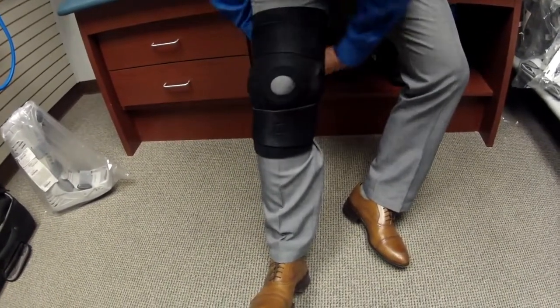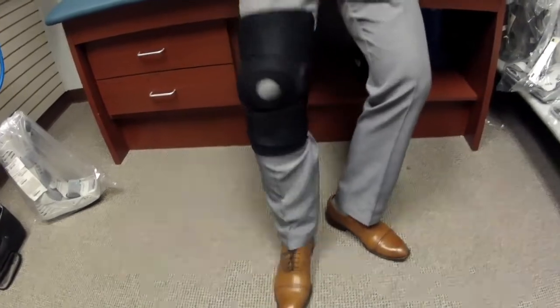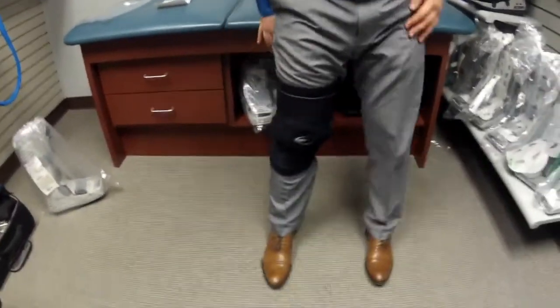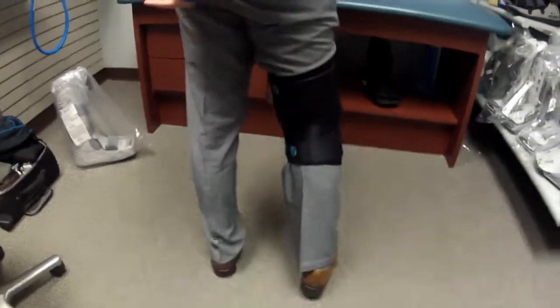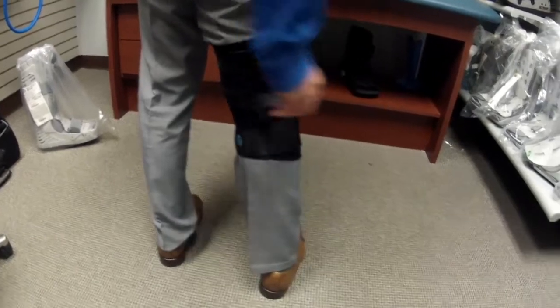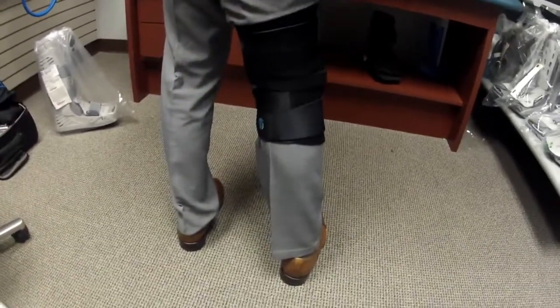Once all your straps are securely fastened, recheck the alignment on the patella and the position of the knee brace, and check for any bulging in the back of the leg. If this occurs, remove the brace and apply again.